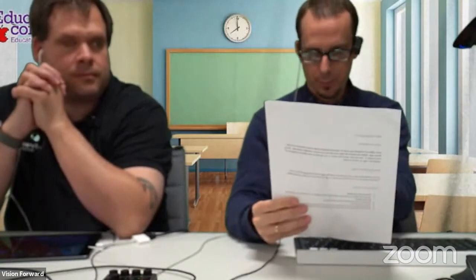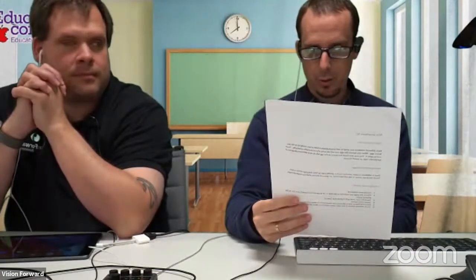So all we have to do with this is we look toward what we want to read, we point at what we want to read, and the camera will see our finger, and it will take a picture of what we want to read and read it to us. Like so. It just took a picture.